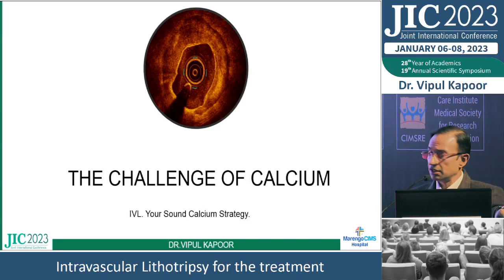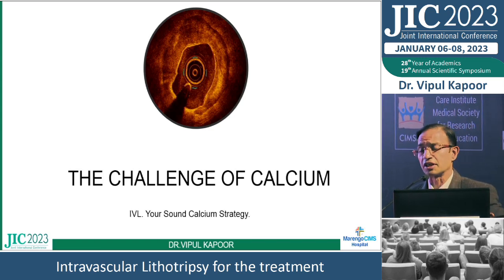So the topic for me at this point of time is the challenge of calcium. I'll be talking about a technology which has taken over the world of interventional cardiology almost like a storm over the past 3 years. Calcium has been a bane of interventional cardiologists for decades. It was one of the main reasons why interventions used to fail, or interventional cardiologists used to deny doing an angioplasty for patients, and they used to go to CABG by default. The moment you saw calcium, you would simply send the patient to a surgeon.